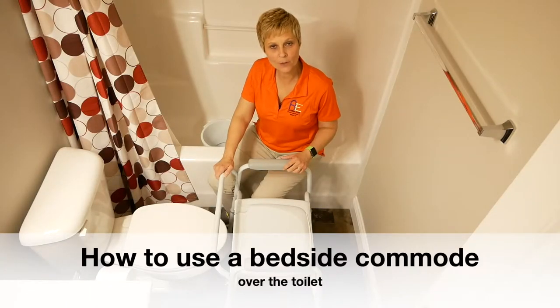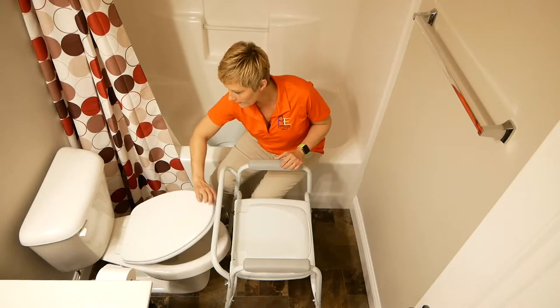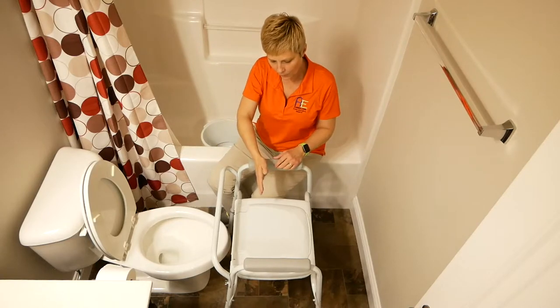Let's review putting the bedside commode over the toilet. When you go to do that, you're going to lift both the toilet lid and the toilet seat. Now when you push this back over the toilet, sometimes you want to push it back further to line up the holes.